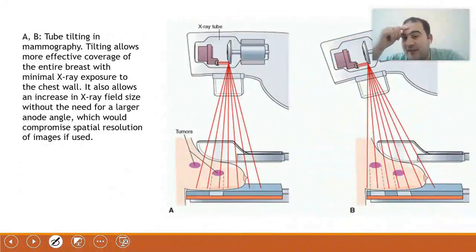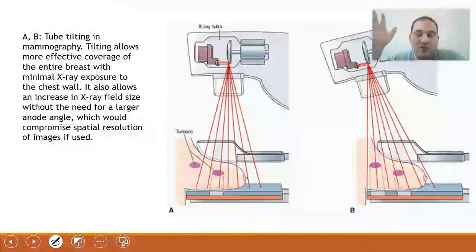I saw this in the modern GE machines used in stereotactic procedures, which give me these options. Some devices, of course, do not have this. The whole idea is about the cost. I saw that you choose the target and select the filter. But as for the mechanism inside, honestly, I don't know.